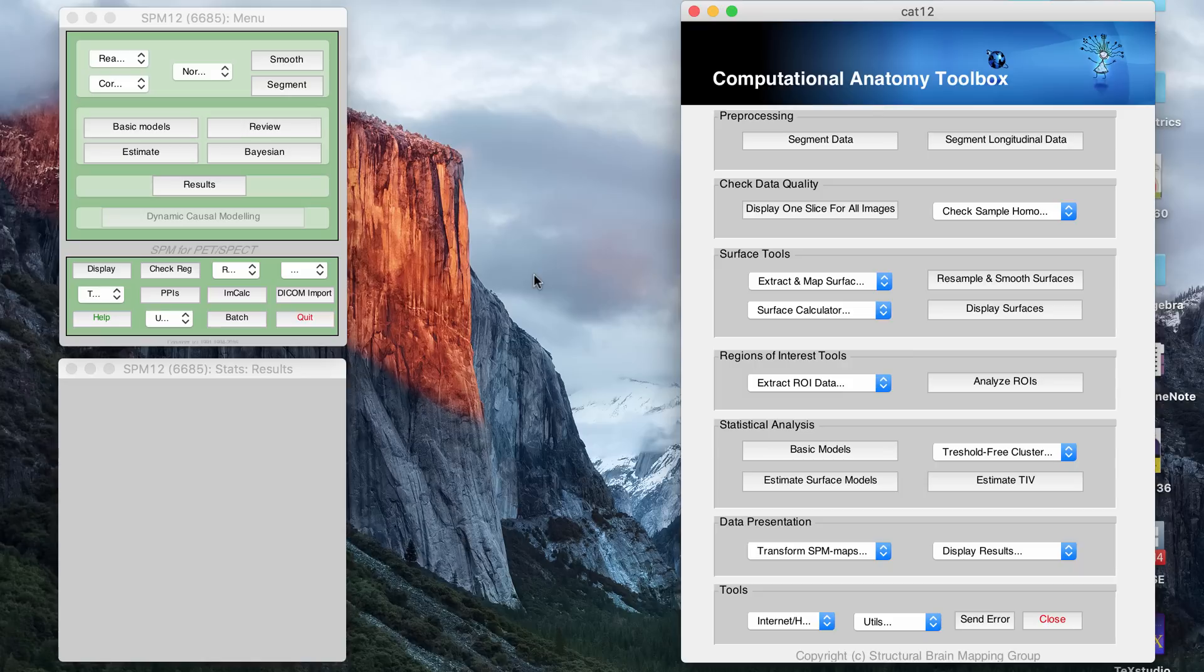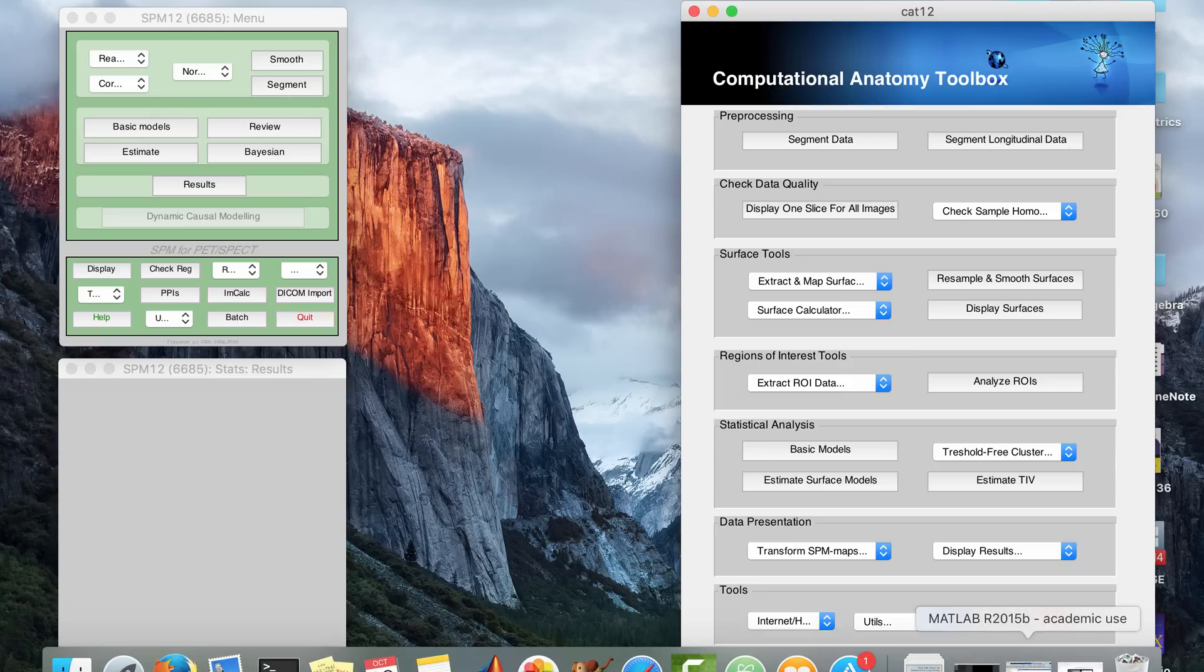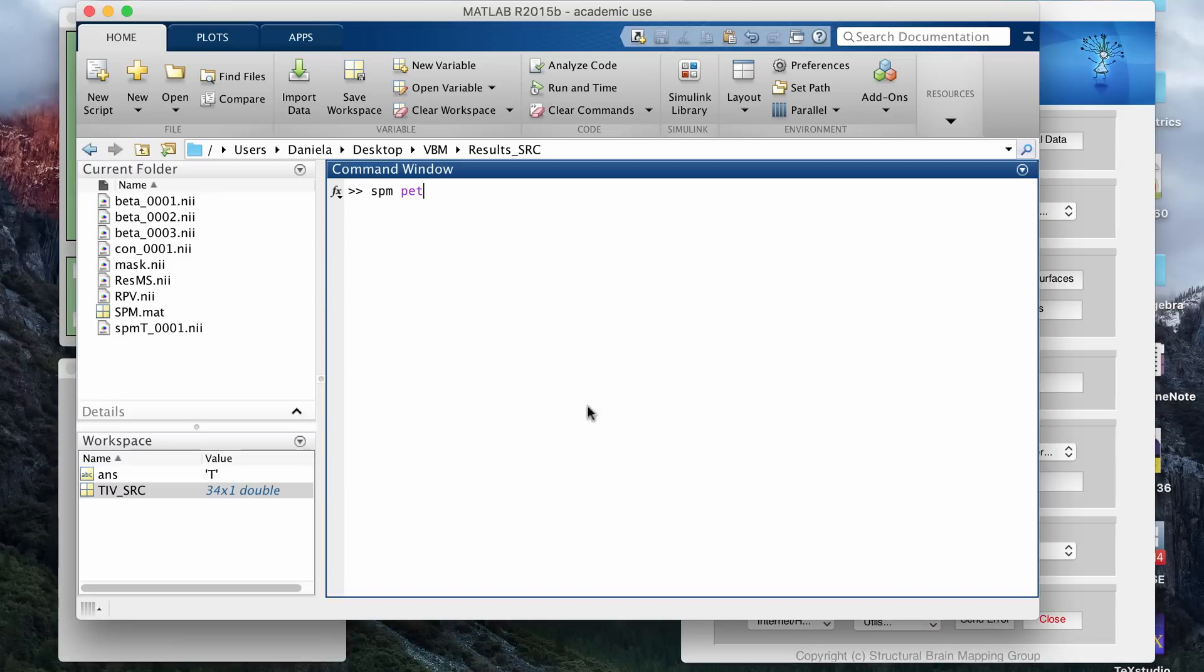So if you don't have any of the programs, you can pause the video and download them. With the exception of MATLAB, which you need a subscription for, all the programs are free.